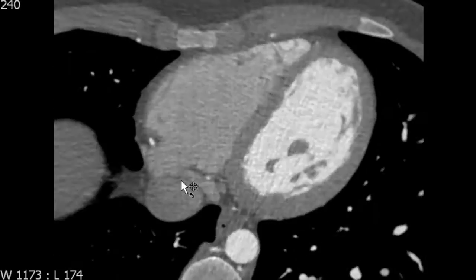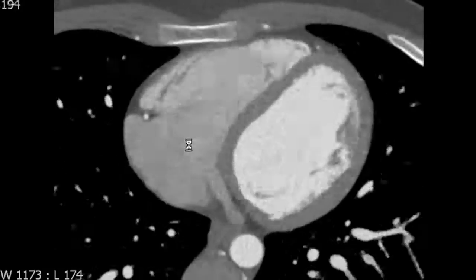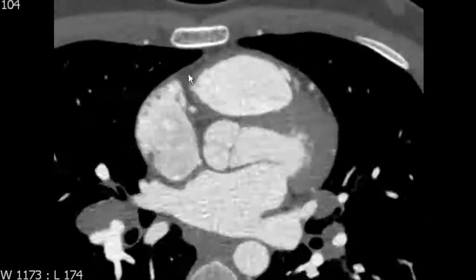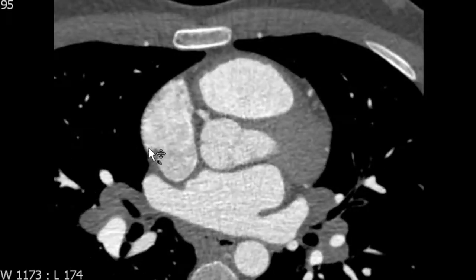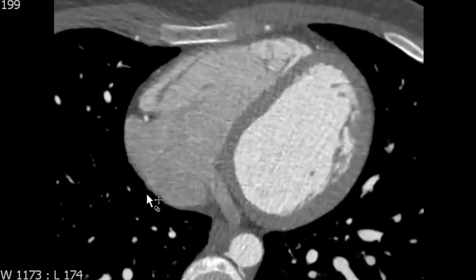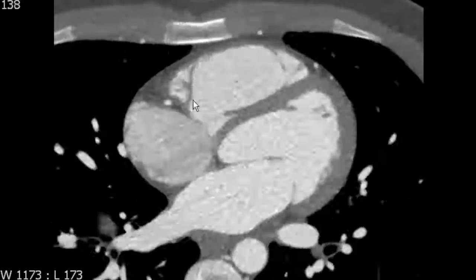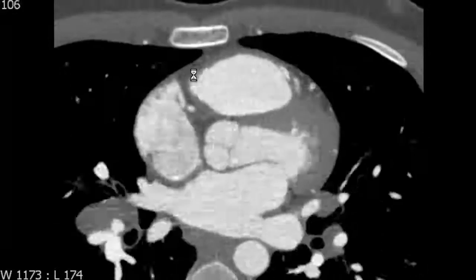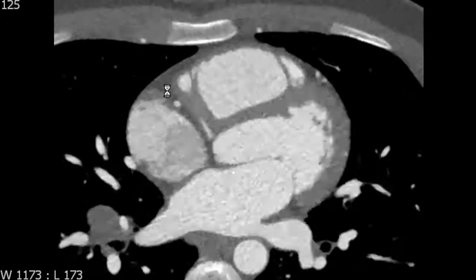The ridge separating these two components is the crista terminalis. It extends from the margin of the junction of the IVC and the right atrium up to the junction of the SVC and the right atrium. In some patients the ridge will be more prominent, as we can see at the superior aspect, while in others you won't see much of a ridge at all. But there will always be a separation between the trabeculated component and the smooth sinus venosus component of the right atrium.